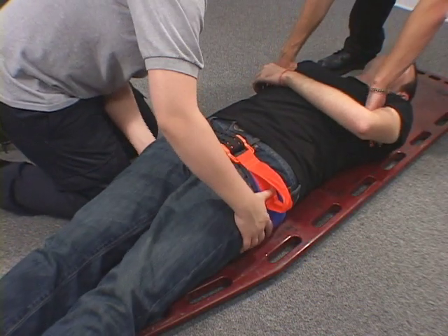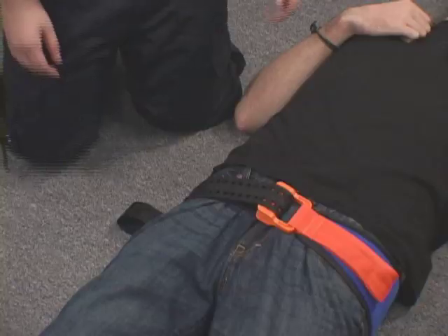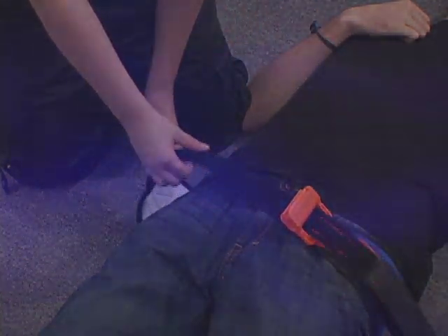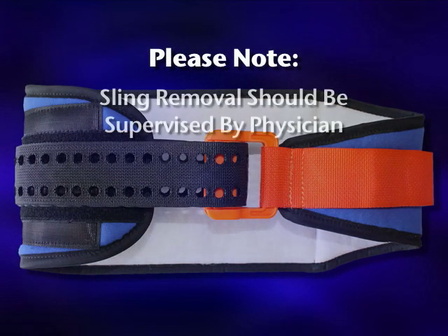Do not be concerned if you hear a second click sound after the sling is secured. To release the pelvic belt, lift the free pull handle away from the belt and slowly release tension. Please note that the SAM Pelvic Sling 2 should be removed only under the supervision of a physician.